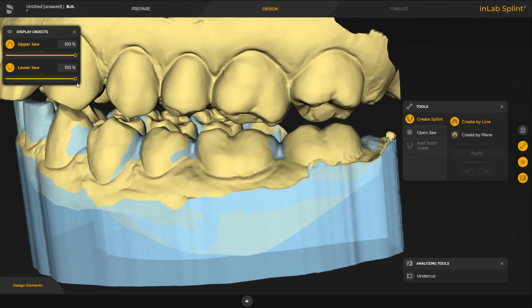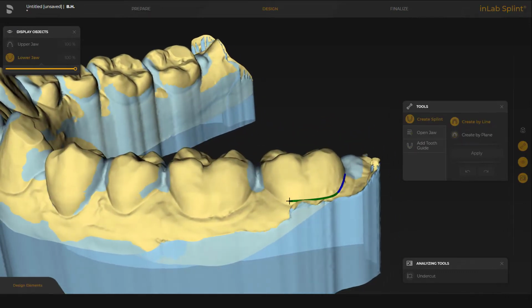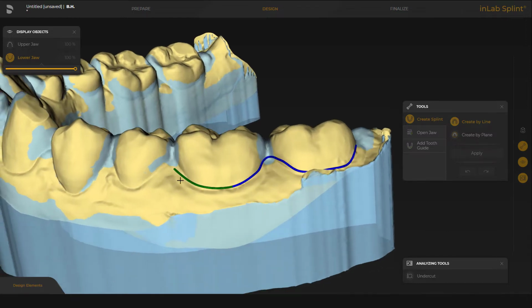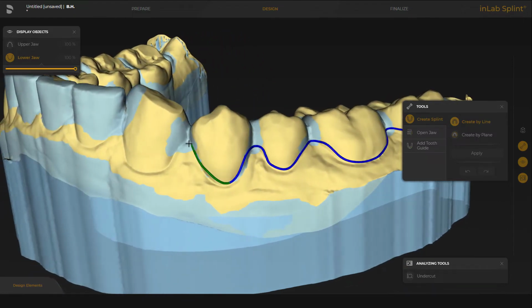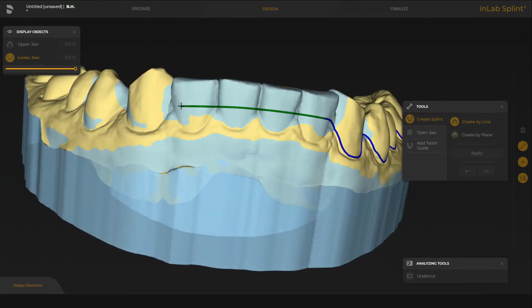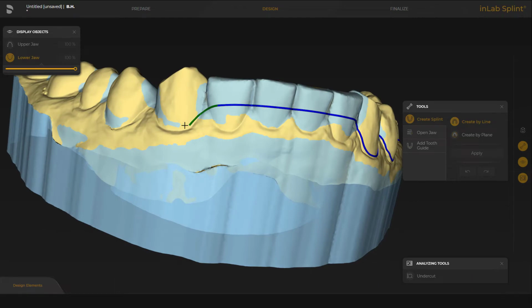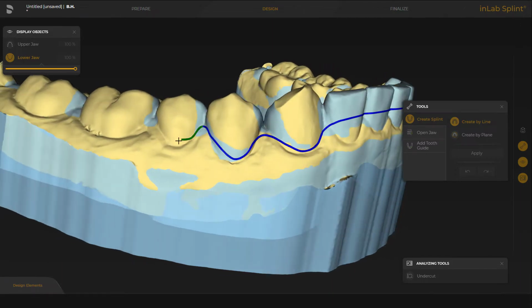I will deactivate the upper jaw again and we'll draw the line. I will draw the line according to my teeth line and gum line. I try not to stay too much onto the gum because when the patient is grinding, it will push down and won't feel very comfortable.